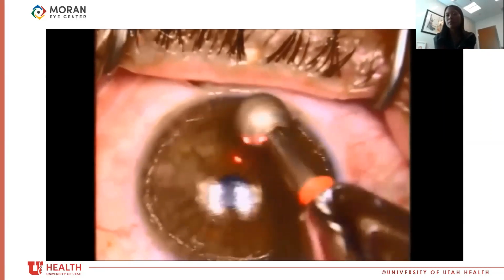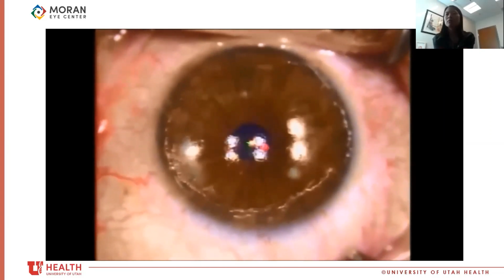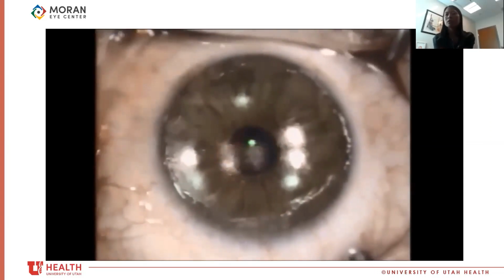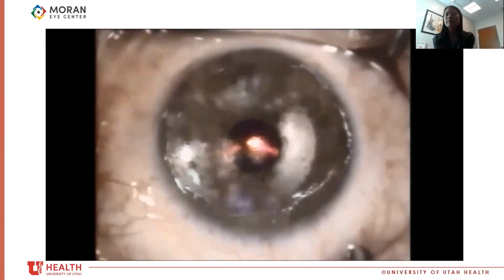You can also induce a little bit of haze. Then I treated -1, so you can see the spots at the center of the cornea. Switched the card, went over to a +1 treatment, and you'll be able to see the spots in the periphery with the +1 treatment there.